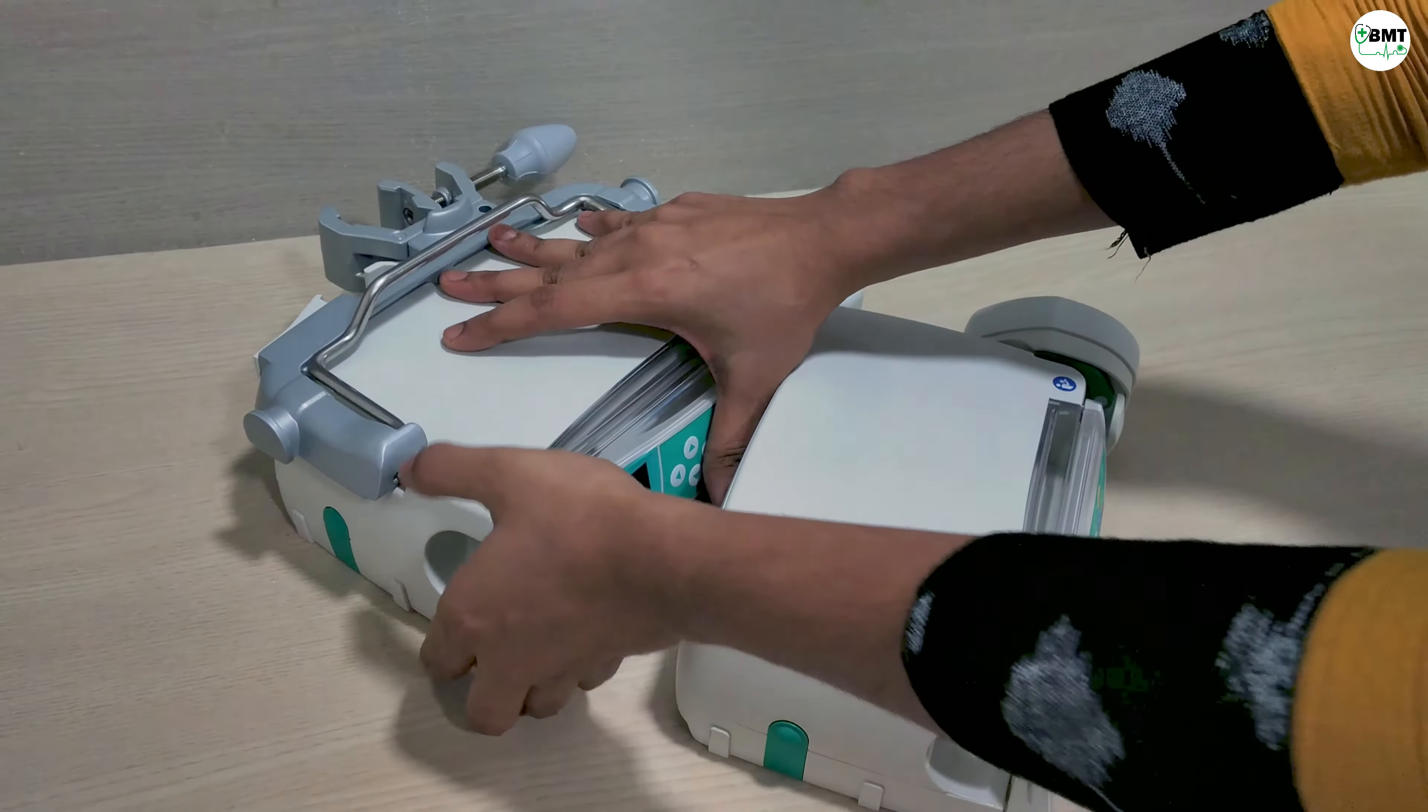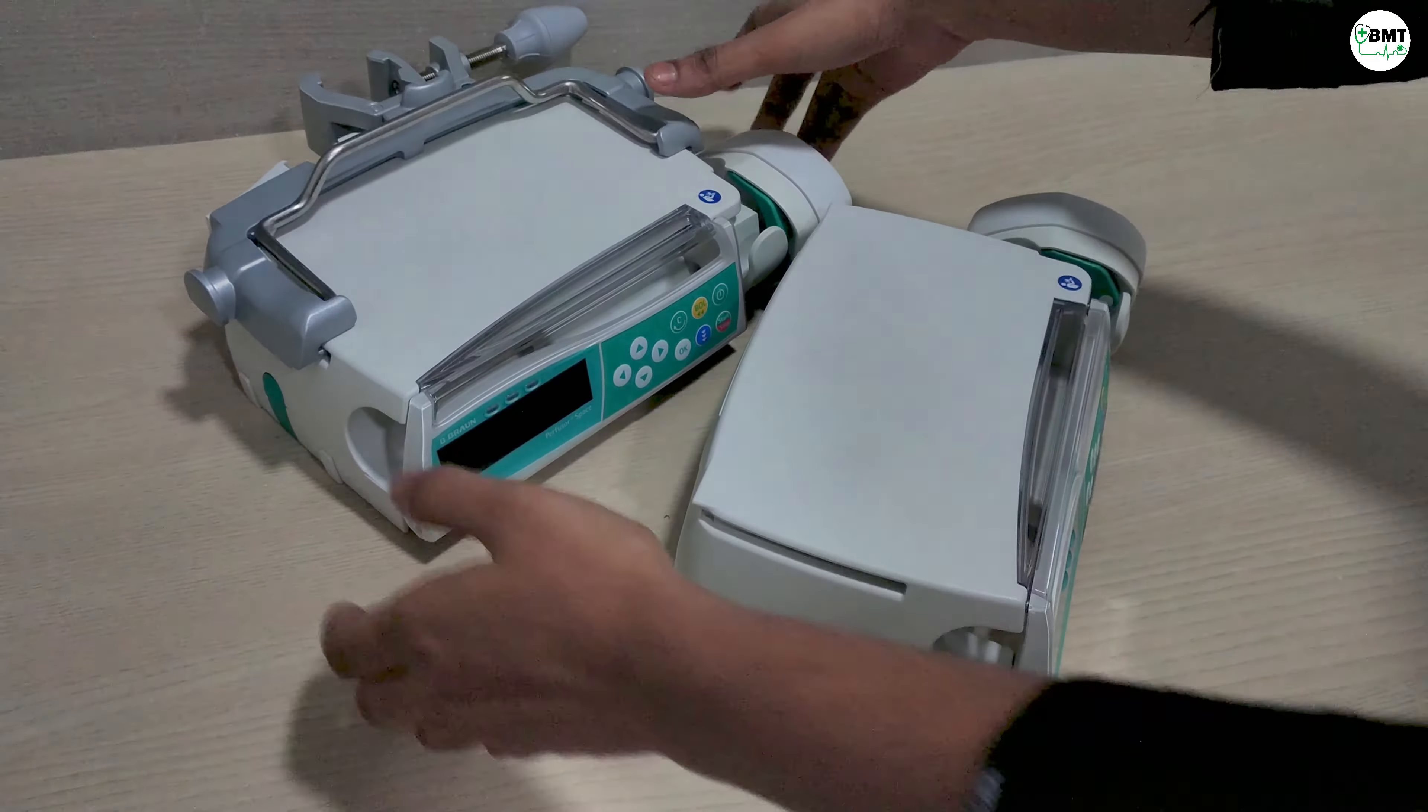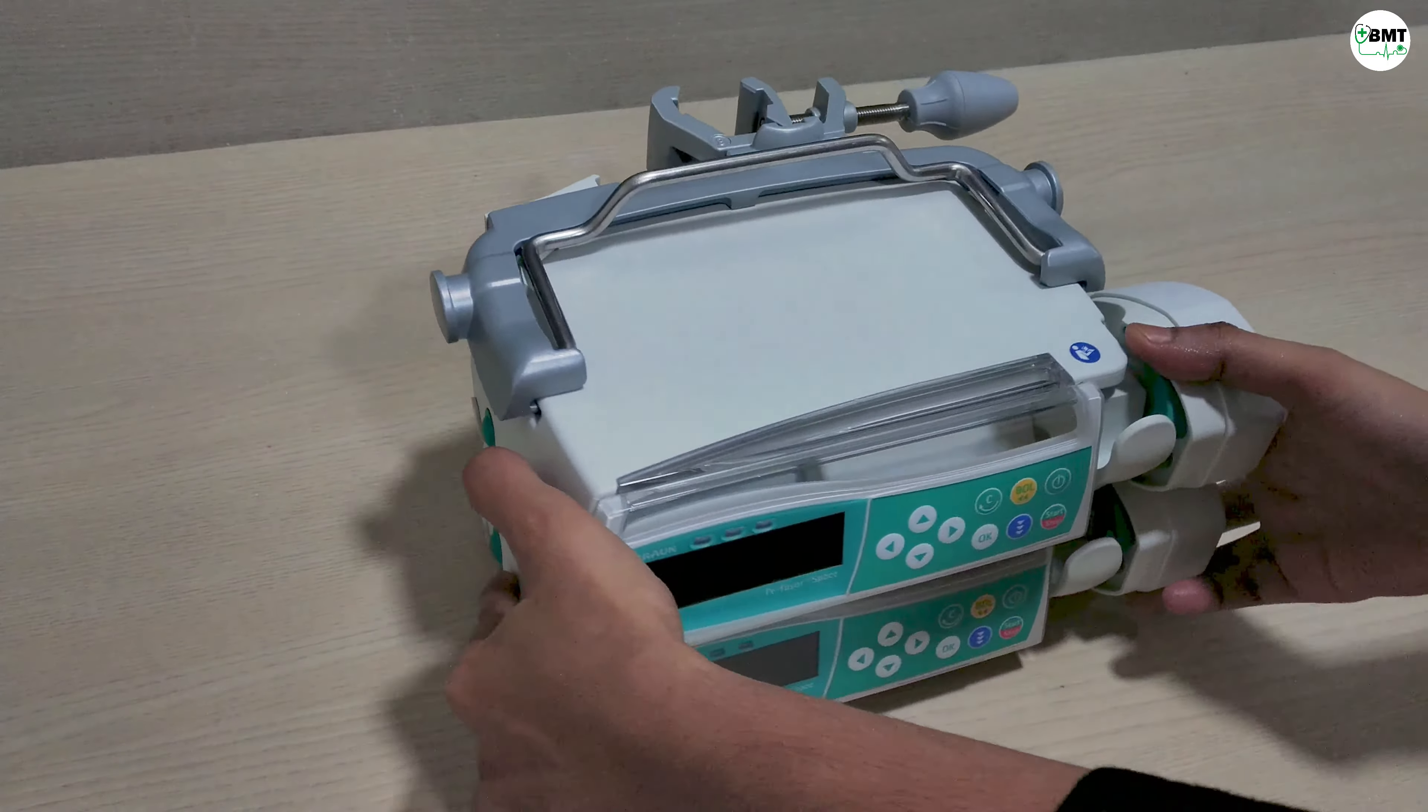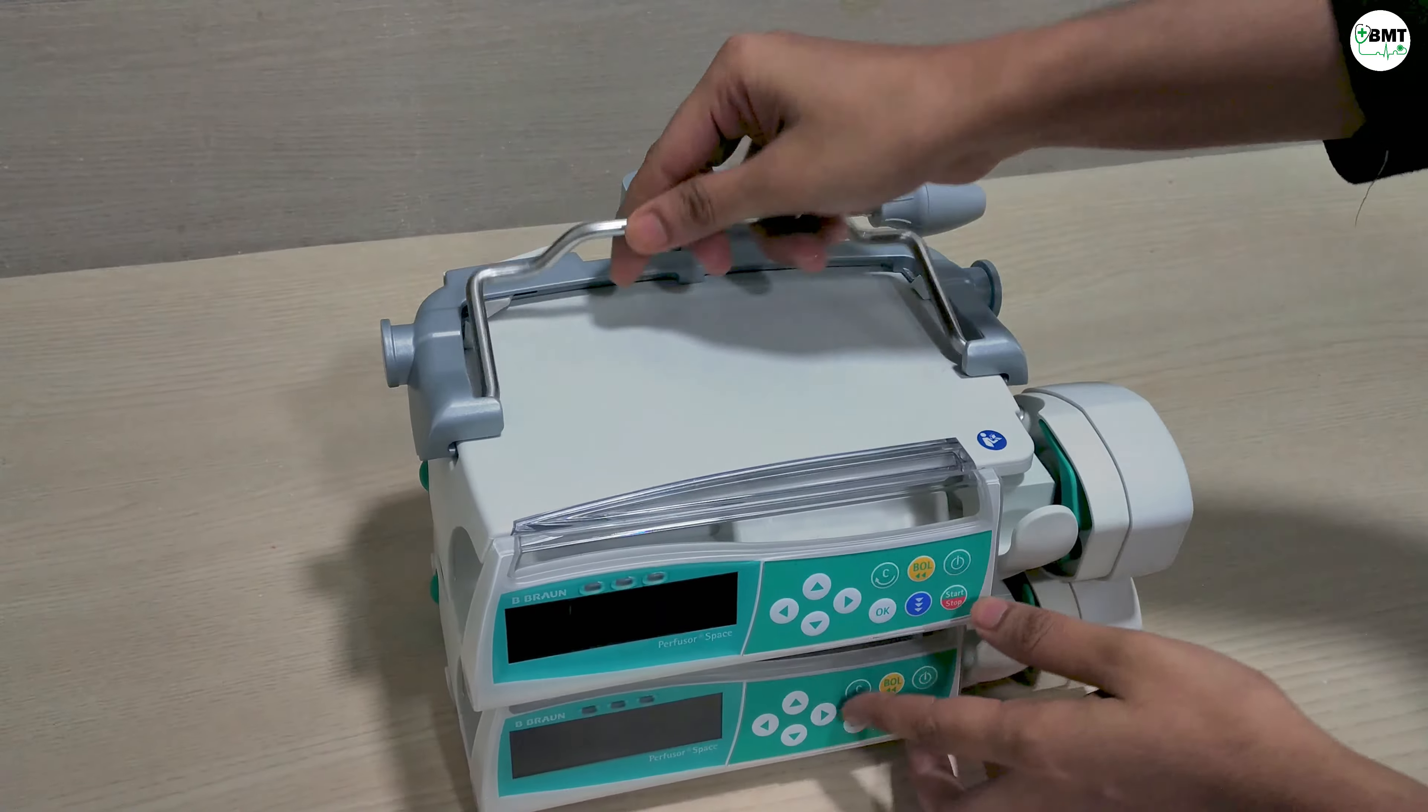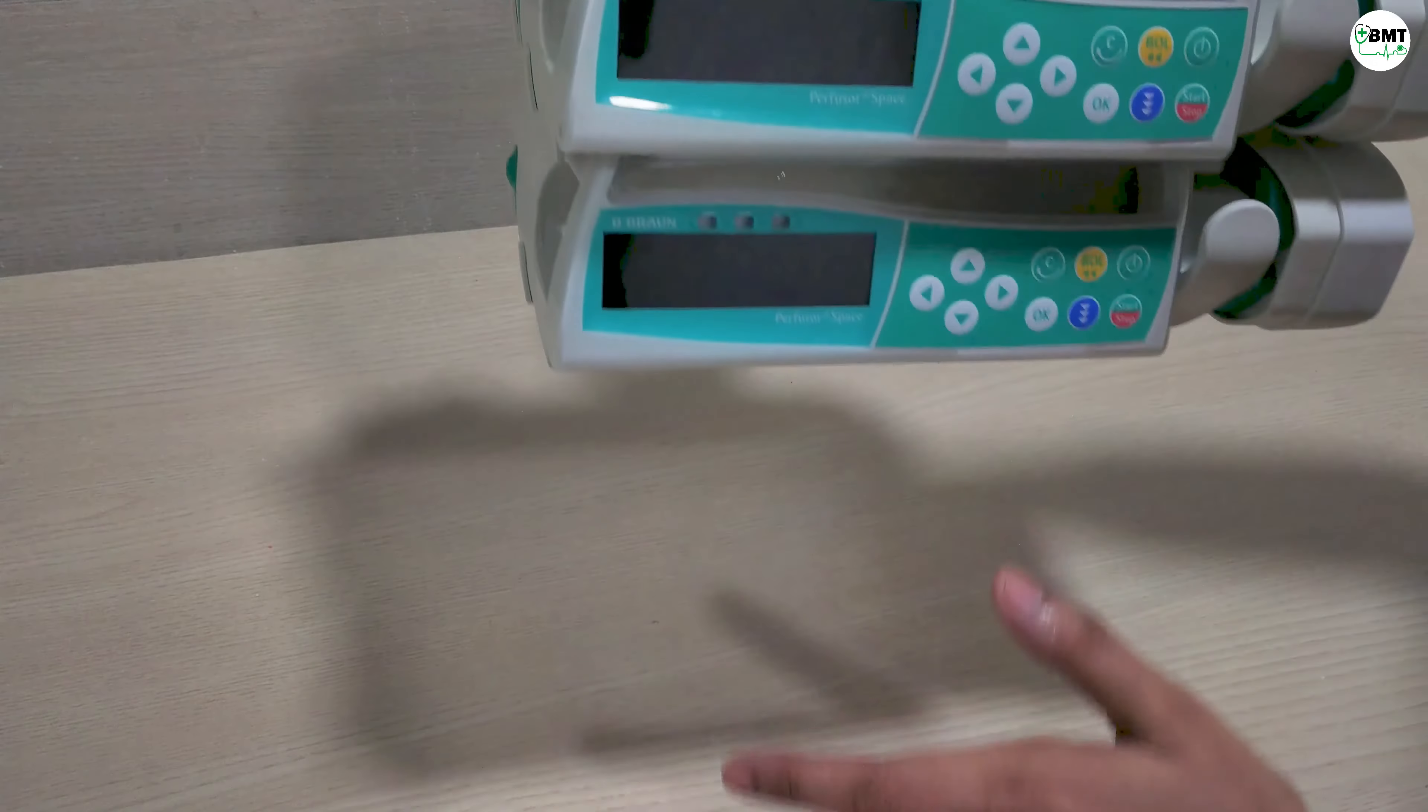For stacking the syringe pump, match this slot with this slot. For stacking syringe pump you have to remove this pole clamp first of the rest all syringe pumps. In one stand you can stack many syringe pumps.